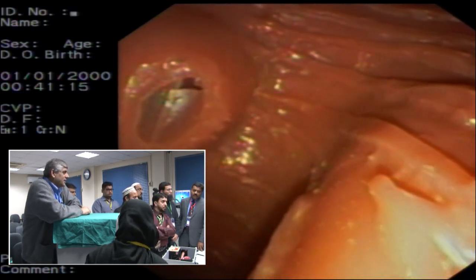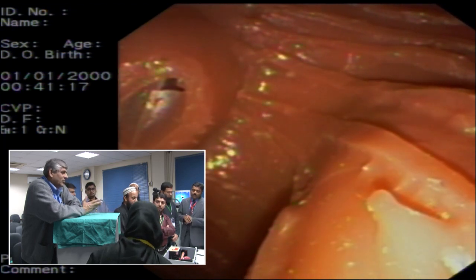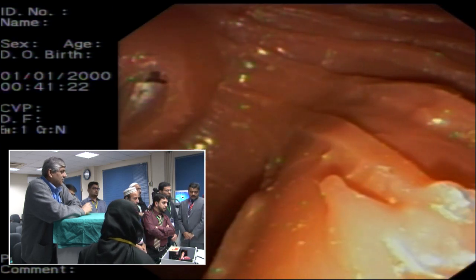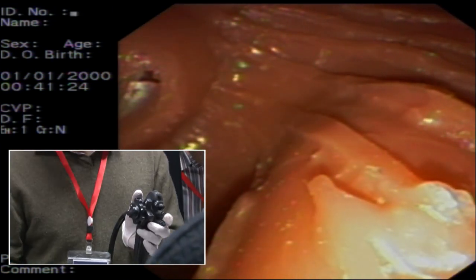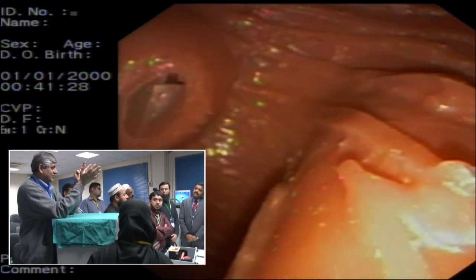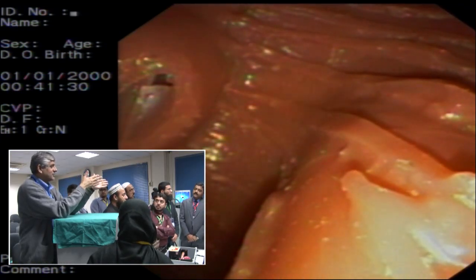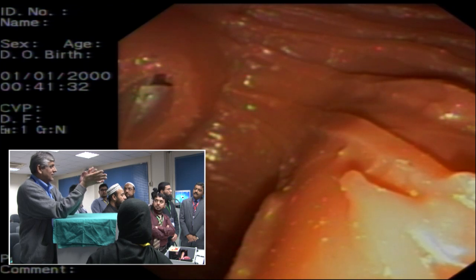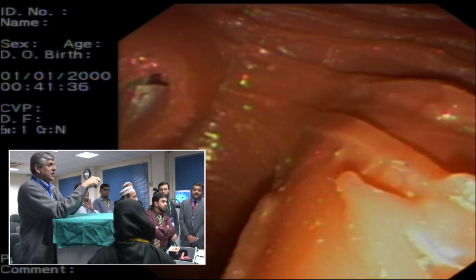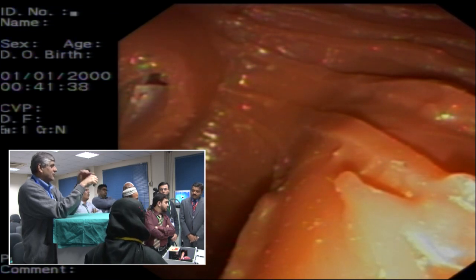Okay. So you can have a cannula now. हाँ जी, देखो ना. Some of the things are very important. You need to discuss it with your technician. So Shahid, you're starting your practice, you have techs who are not trained. It would be nice if you can send one of your techs here, and they can spend a week or 2 weeks. I think that would be very important. That would be very helpful for you.